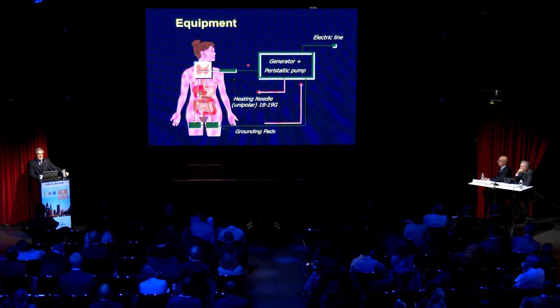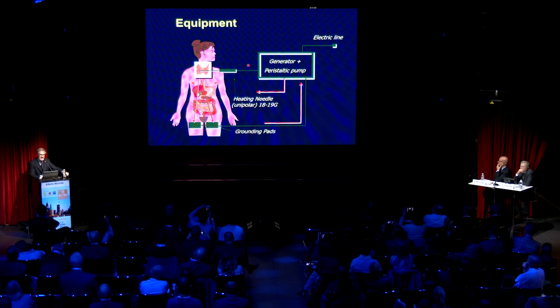Some words about the equipment for radiofrequency thermal ablation. There is a radiofrequency generator and an electric pump, ground pads, and a unipolar needle.